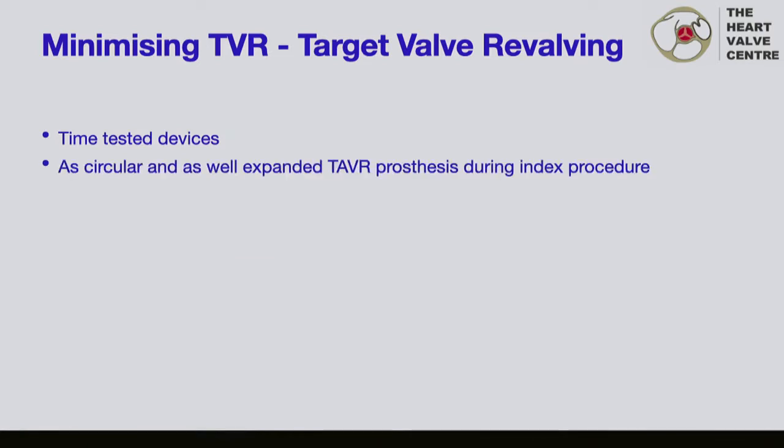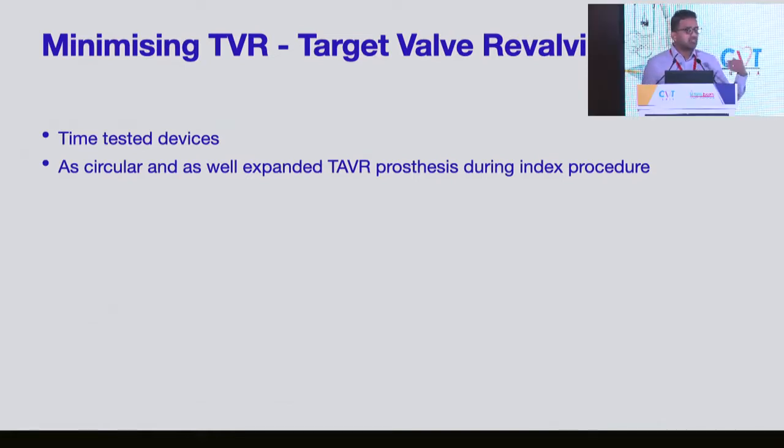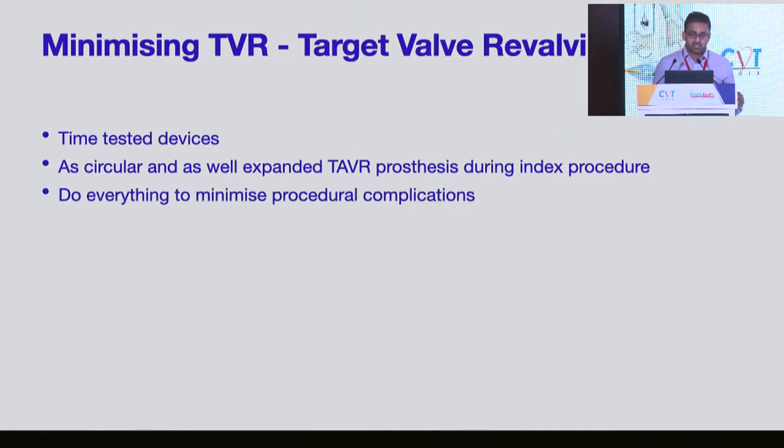As circular a morphology of the TAVR is what you need to achieve, because this rapid testing in these factories happens with a fully expanded valve, and therefore if you don't have a fully expanded valve, your longevity is not going to be the same as you would expect. Try to make sure there are absolutely no gradients, and do everything possible to minimize procedural complications.